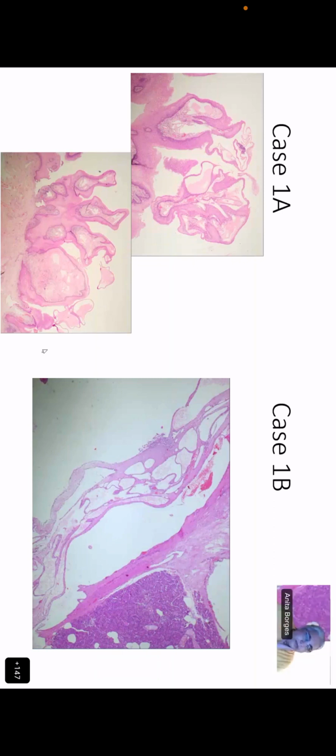Yes, ma'am. I think that if I draw a line from here, I see that these projections are above this basement membrane. They are above the surface. You don't mean this basement membrane, you mean the surface, right? Yes, ma'am. Yes, okay, very good. So they are above. So everything that you see in pathology that is above the surface is a papilla. Is that what you're saying, Dia?